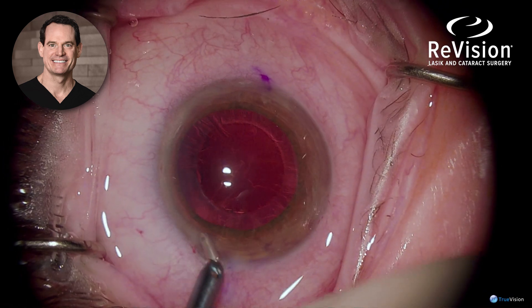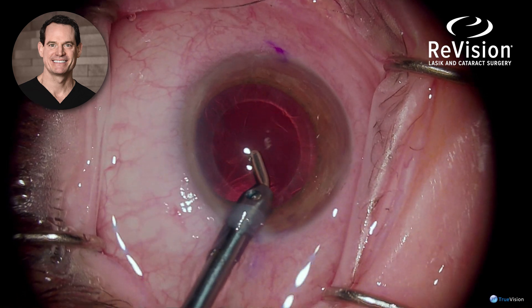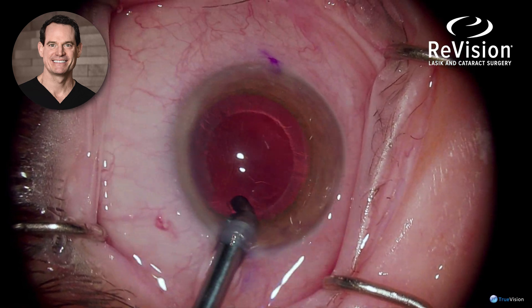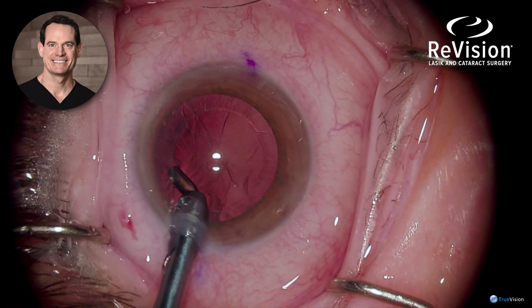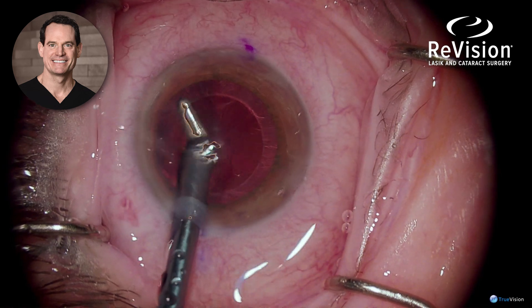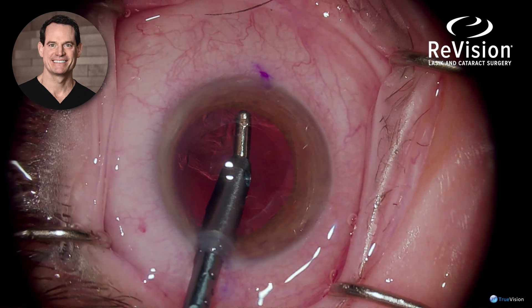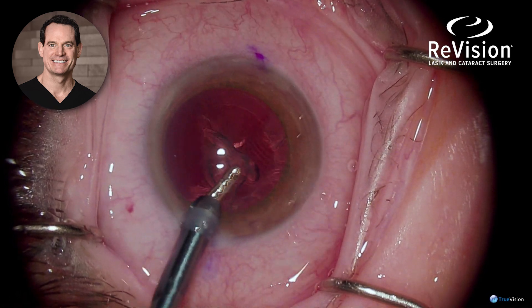After the nucleus is removed, the cortex of the lens is then removed using the irrigation-aspiration handpiece. The cortex does stick to the edge of the laser incision, so it comes out a little slower than a manual case, and you have to aspirate near the edge of the laser-assisted capsule rhexis.